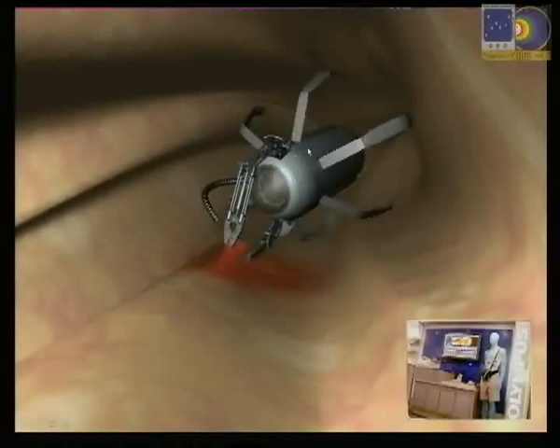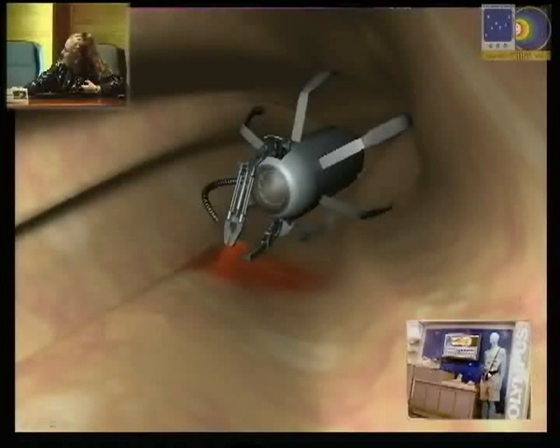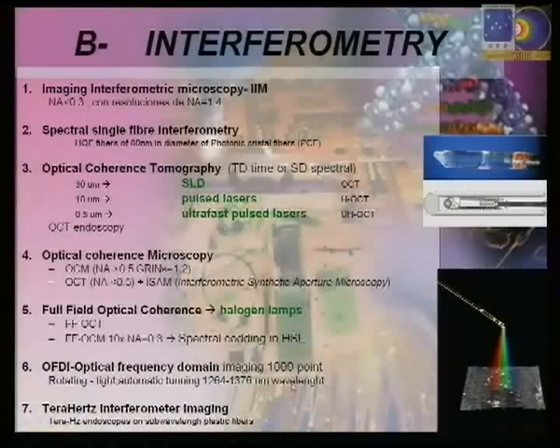The capsule is almost empty. So that means that you can put a lot of things inside. You can put treatment, you can put immunodetectors, you can put a lot of things inside of the pill in order to make the diagnosis. And the system is tracked and moved, although this is the Olympus, the previous generation, but in any case the system is tracked and moved from the outside with an electromagnetic field, and outside you can see the images directly.